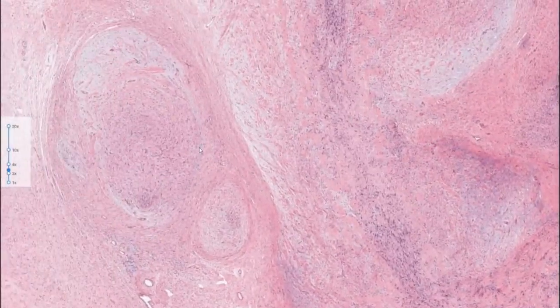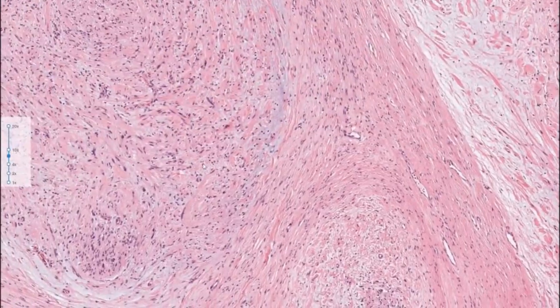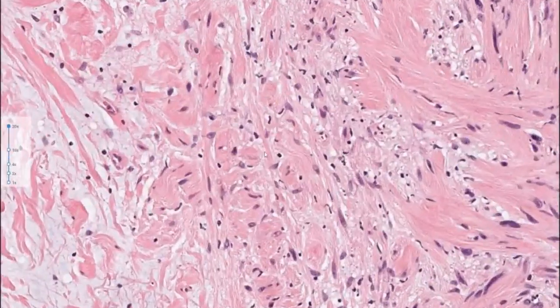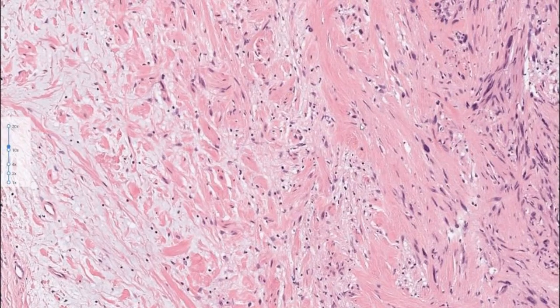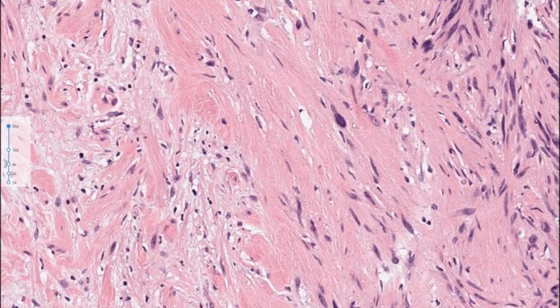You can argue that it has some overlap with the previous lesion, at least at the morphology level, but here the fascicles have more of an expansion. They're expanded by a Schwann cell proliferation. And if you see this in high power, this is not a difficult diagnosis, right? It's a neurofibroma of some kind. You have this shredded collagen type of pattern, myxoid change, and a mixture of predominantly Schwann cells, maybe some fibroblasts and other components. Here you start having some degenerative type of atypia.